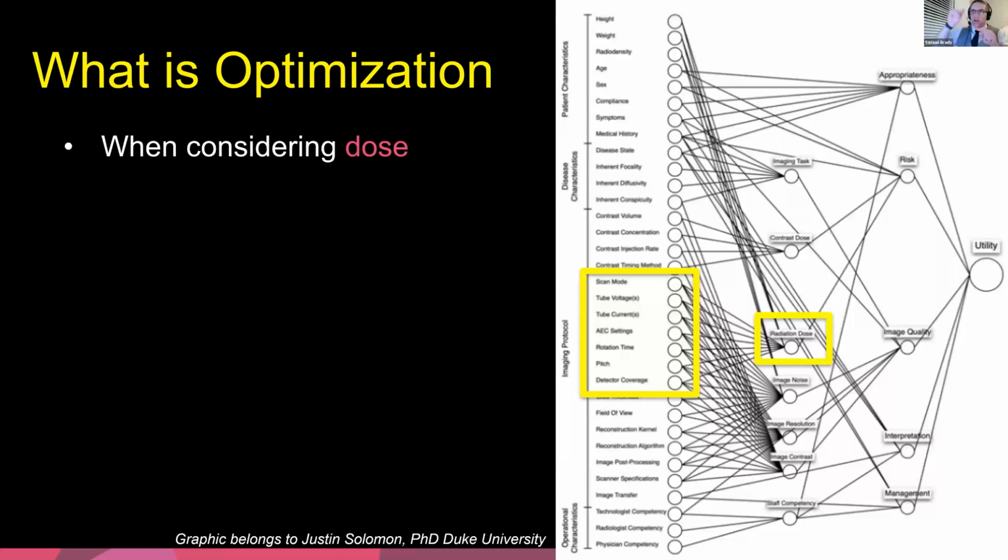And then when it goes from this neck to these shoulders, it needs to go up really quick. And to get it to go up really quick, you either have to have a very low pitch so the system can modulate quickly, or you start at the bottom and you go up. And so it starts at the high dose, and a system can reduce the dose pretty quick. And so you can go normal dose, high dose, down to low dose, and the system is perfectly fine doing that.